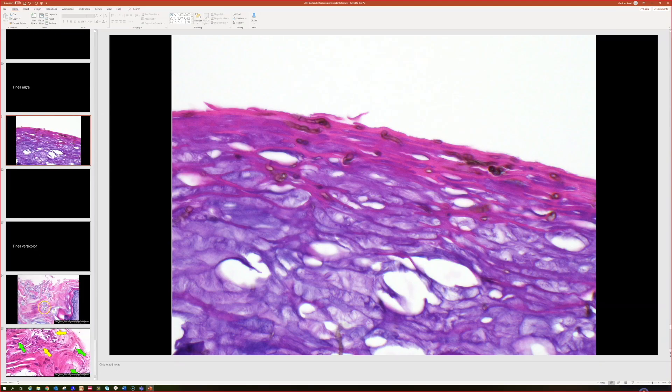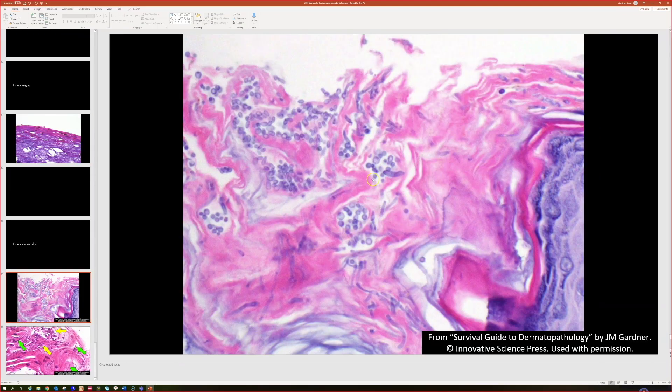And here for the final pictures, here's a closer view of very nice yeast, and you can see they're budding yeast. So when they're round and they're making buds, you know it's yeast, and then they've got the hyphal structures here.